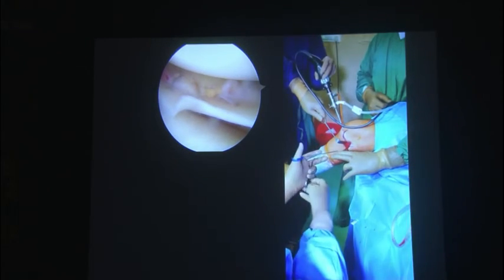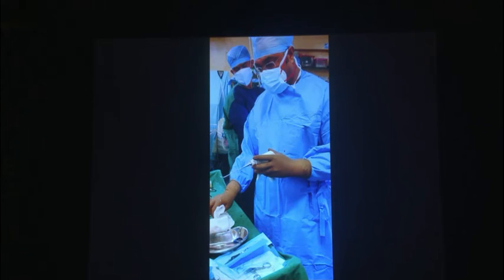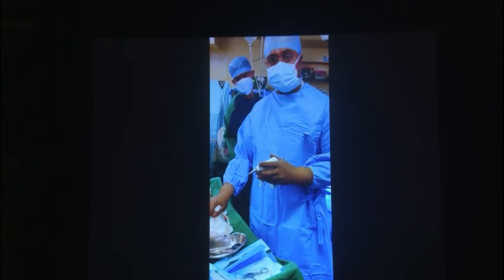That's the typical position — this is the assistant, that's me holding the camera. The next best thing is you can also approach the mid body through these same portals. This is the zone-specific cannula which is for the mid body. Until now, what you saw was for the posterior horn. Now you have a device for the mid body, angulated in such a way that you can come from the same portal — so if you are repairing the medial meniscus, you come through the medial portal itself. That's the beauty of having zone-specific cannulas.